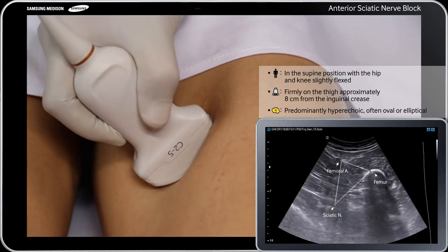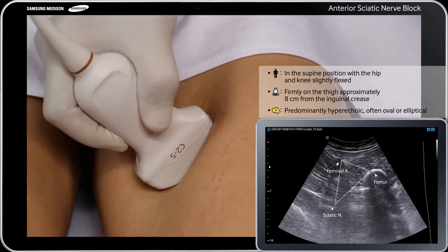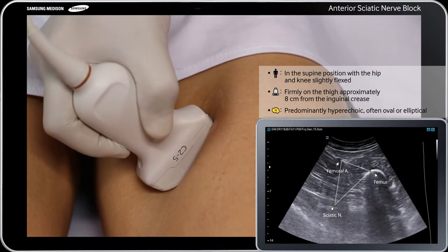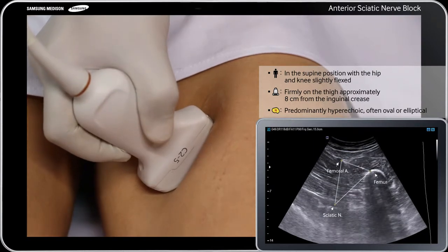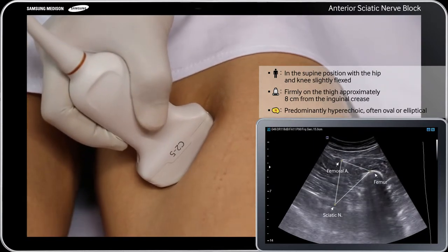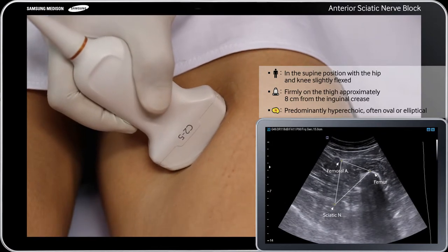The sciatic nerve in the proximal thigh appears predominantly hyperechoic, bright, and often oval or elliptical on ultrasound.